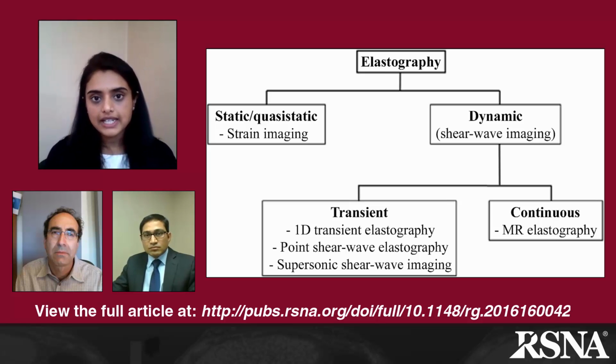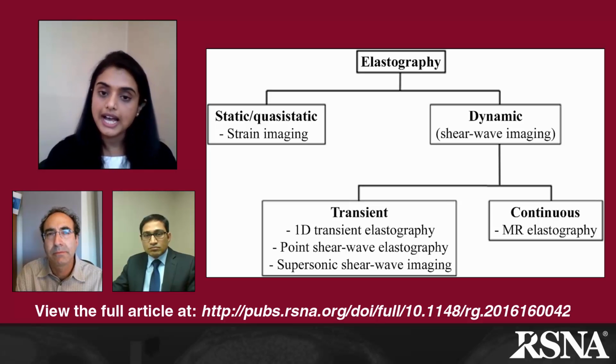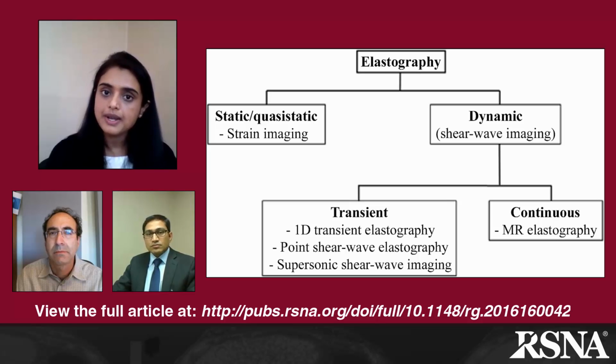In static techniques, a series of compressions are used as mechanical force, and deformation within a specific lesion is measured with respect to deformation of surrounding tissues. It has been particularly useful in breast and thyroid lesions, but because the liver is a deep-seated tissue, it's less useful in assessment of hepatic fibrosis.